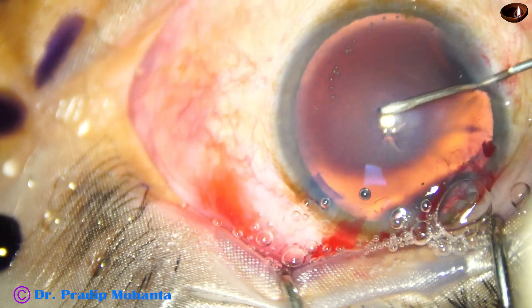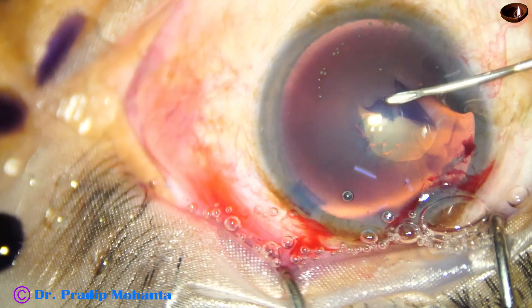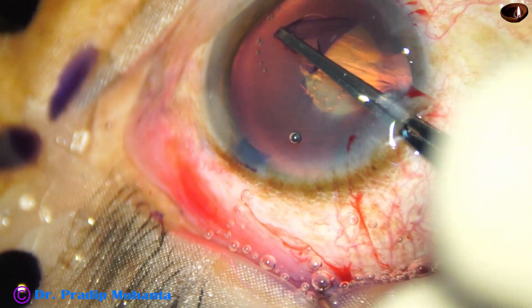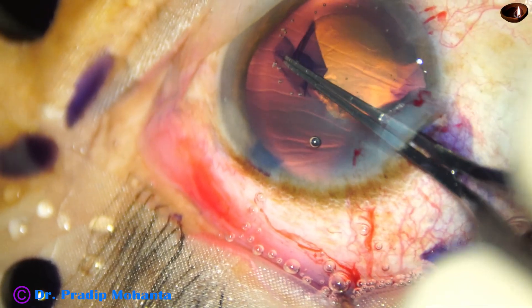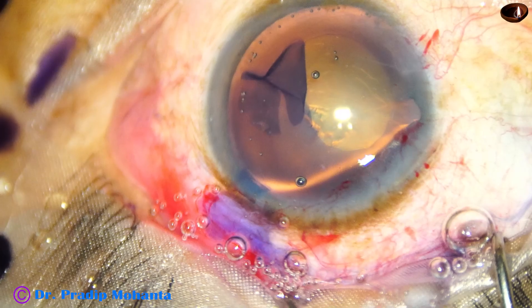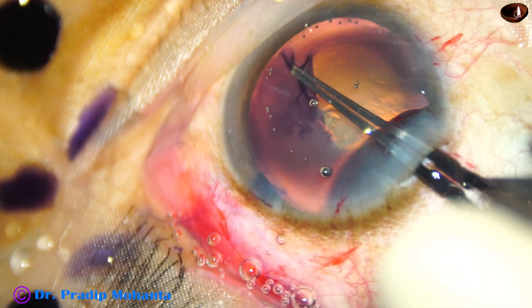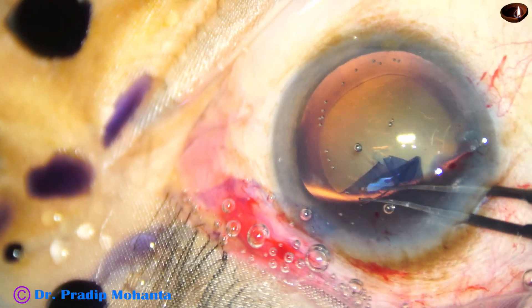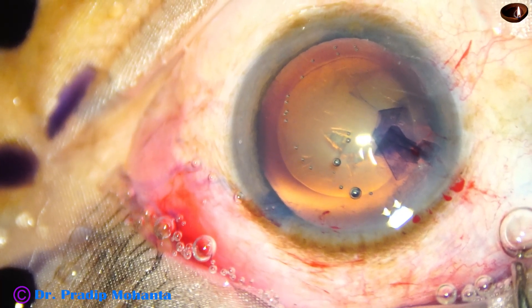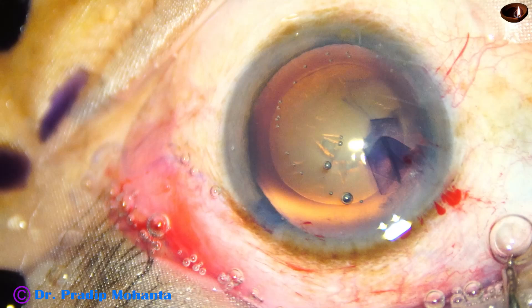Now capsulorhexis — if you are doing capsulorhexis with the needle through the side port, you can continue that. This is how you can learn. Use the forceps, go through the main wound, inject Visco, lift the anterior flap of the capsulorhexis. You may find that the AC becomes shallow — inject Visco and go again. Lift the flap, hold the tag, rotate the tag, and complete the rhexis. You may have to refill the anterior chamber two or three times initially; later you will be able to maintain the depth and complete the rhexis at once.